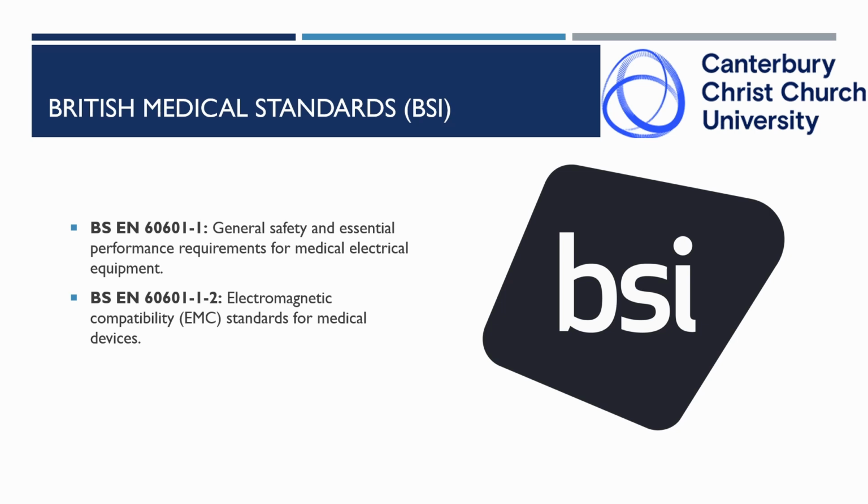Medical standards. Other important standards, such as the British medical standards, cover biocompatibility, ensuring that materials in medical devices are safe to use, especially those in contact with patients, and won't cause adverse reactions. And then usability, designing the device to be easy to use and minimizing the risk of user error, as outlined in the user manual. By adhering to these comprehensive standards, we can ensure that the spirometer is a safe, reliable, and effective medical device.